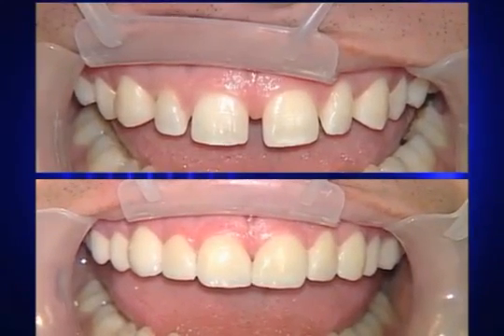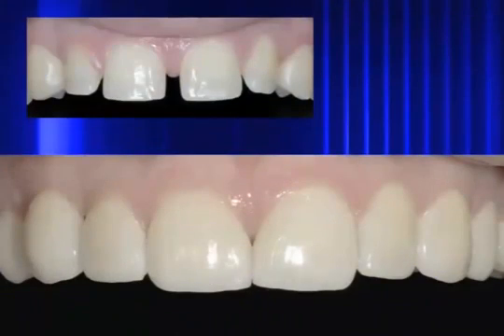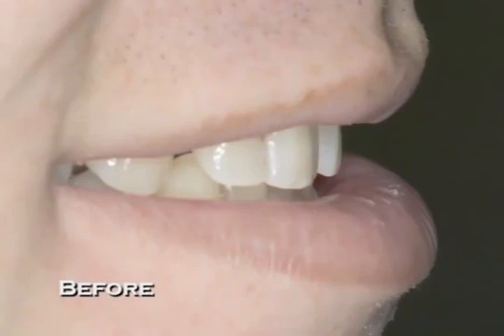This case illustrates one of the really good uses for no-prep veneers. The patient came in with multiple diastemas between his teeth, and he could use a little extra tooth length as well. Since there wasn't a big requirement to remove any tooth structure, this case really did lend itself towards a no-prep approach.